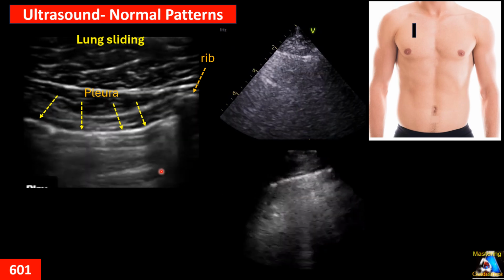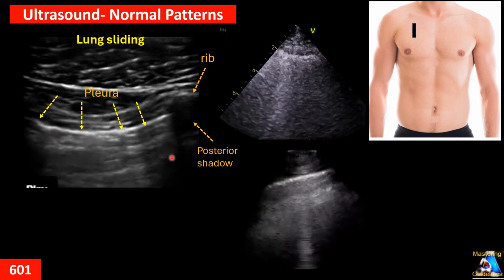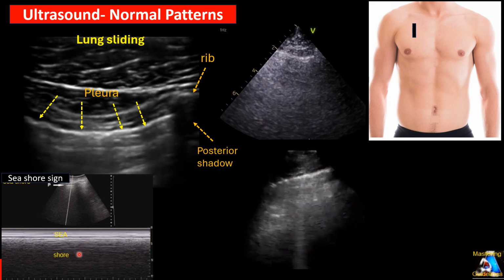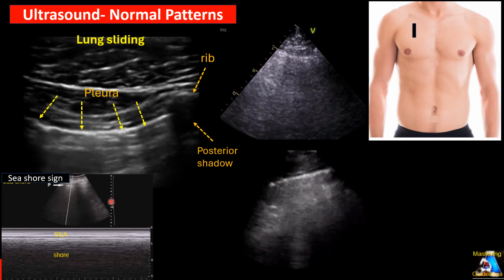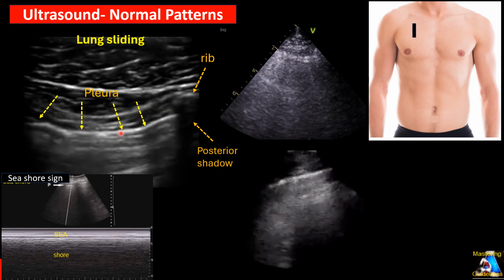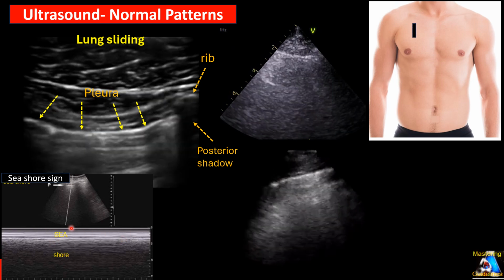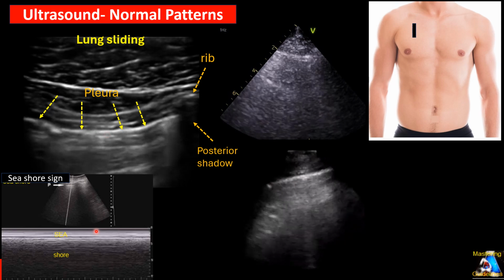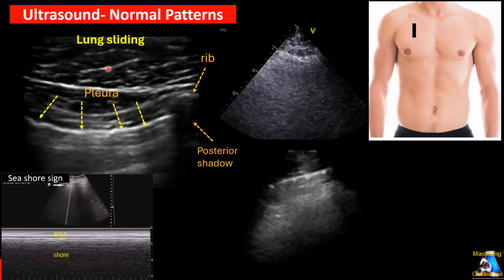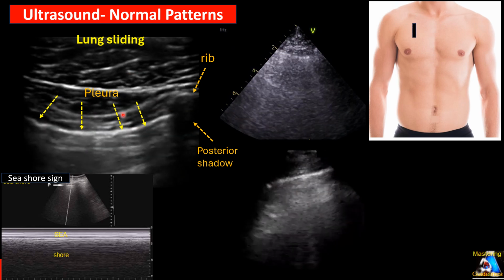With this feature, we can do M mode and find all those structures. When we do M mode on the level of the pleura, we have a specific pattern in the normal situation. We have first those layers that give us horizontal layers up to the pleura. The top one looks like the sea on the horizon when you watch the waves. Those hyperechoic lines belong to those trabeculations and fascia in the muscle between the intercostals and all of them.